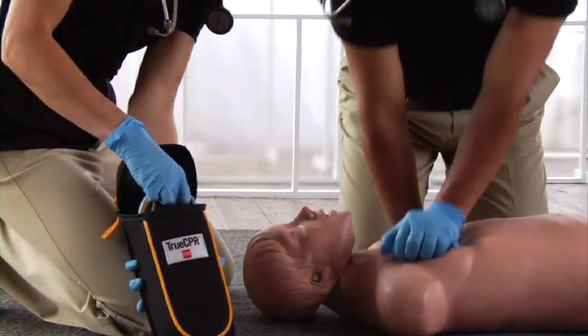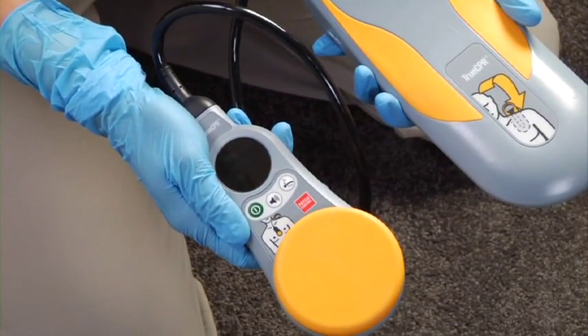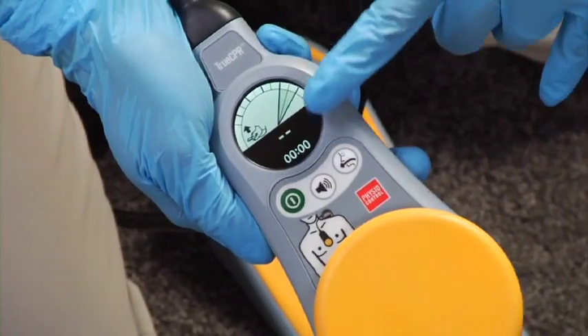Take TrueCPR out of its bag. Separate the chest and back pads and don't press on the chest pad during self-calibration. Push the power button. It calibrates, and the feedback screen appears when it's ready. The elapsed time counter will start when you begin compressions.